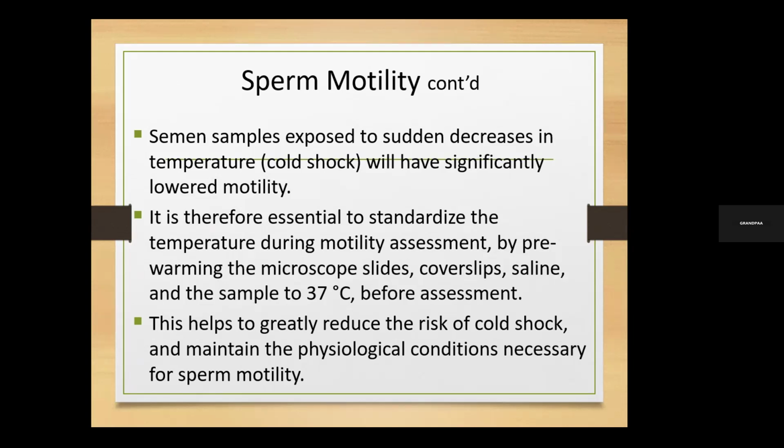I remember I've told you that if you want to do your semen analysis properly and in accordance with WHO standards, you should have a warmer plate.